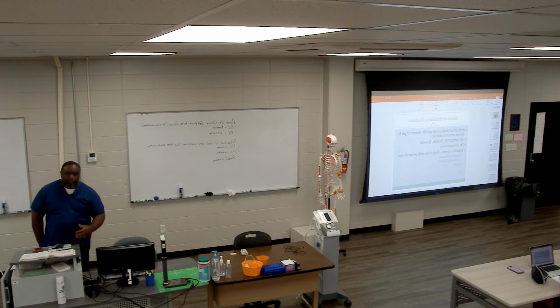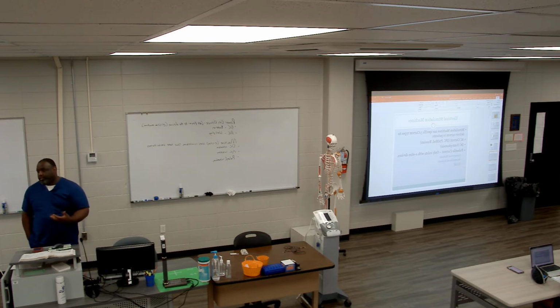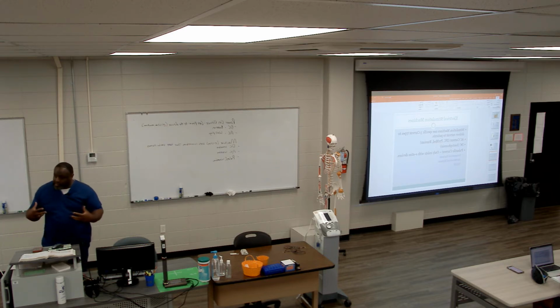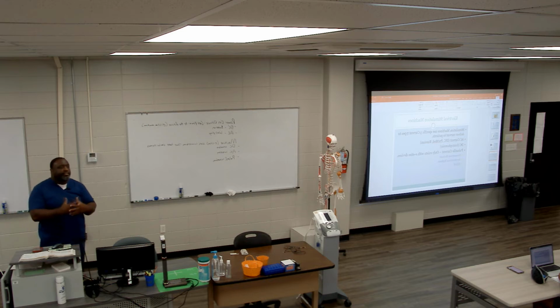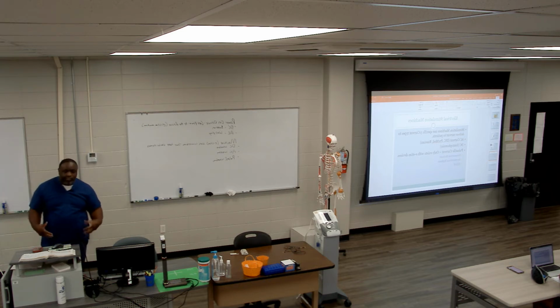All of them will come with an instructional manual, so you'll be able to see what type of waveform they're using, because different waveforms produce different tissue effects. I choose a certain waveform because I'm trying to get a specific effect in the tissue that I'm treating.